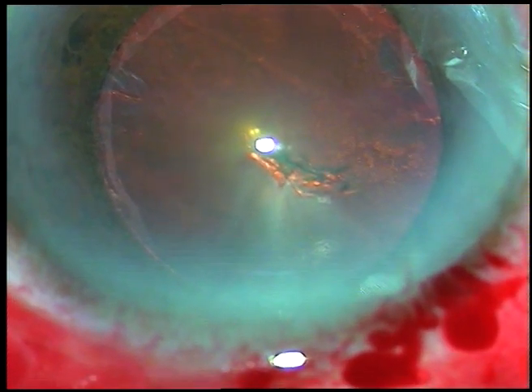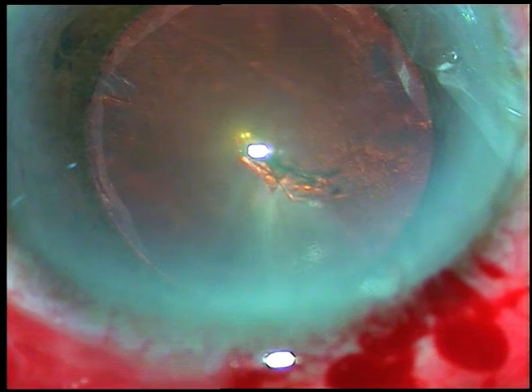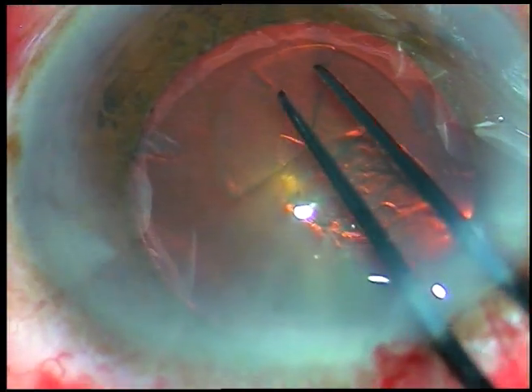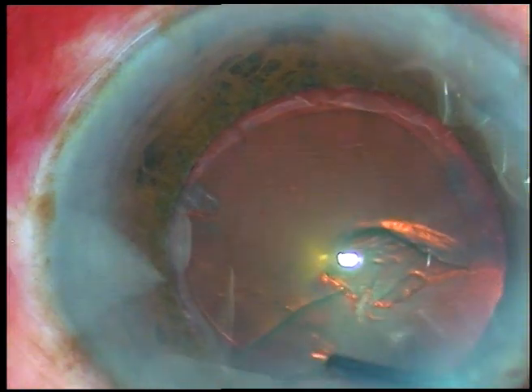I usually go anti-clockwise; many colleagues go clockwise — it depends on your natural hand movements. So hold the tag and go anti-clockwise. In this case the pseudo exfoliation material is acting as a rhexis marker. The rhexis has been done.